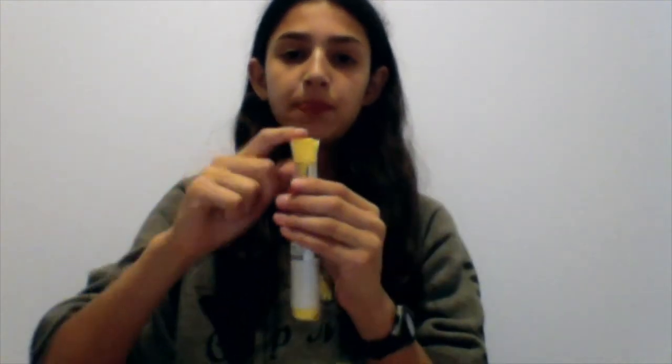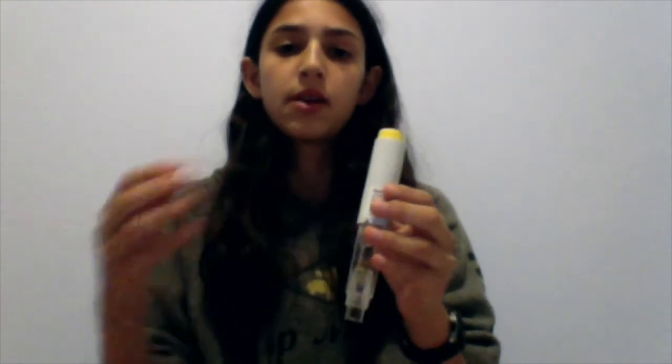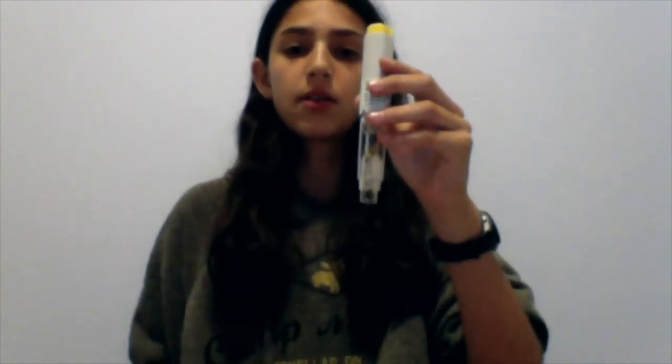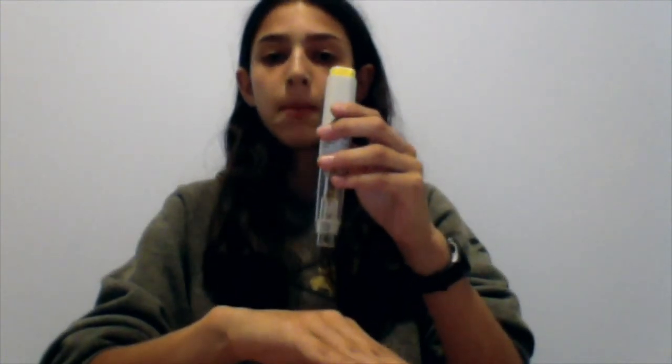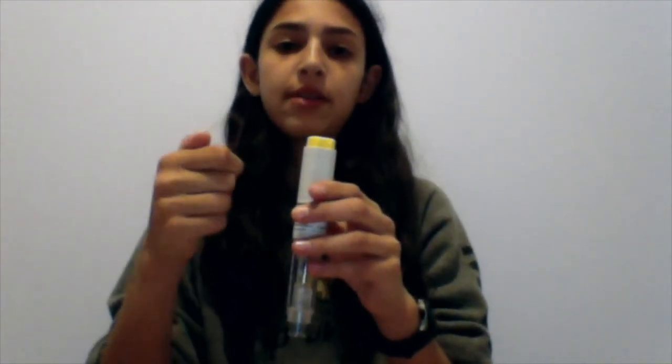Your first step in getting the injector ready is to pull off the yellow top right here — it feels kind of weird but you're just going to pull it back. So now the injector is ready. It's kind of like a spring. You're going to take the circular clear plastic part and press it down all the way onto your injection site. Then the yellow button up here, you're just going to push it, hold it on your leg or stomach or wherever you're doing the injection, and count to five seconds to make sure all the liquid goes in. Then you just take it off the injection site and you should be good to go.